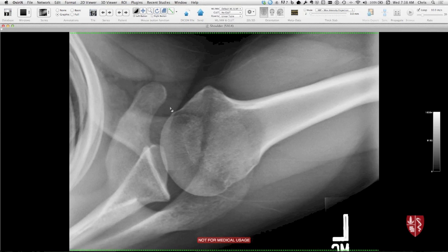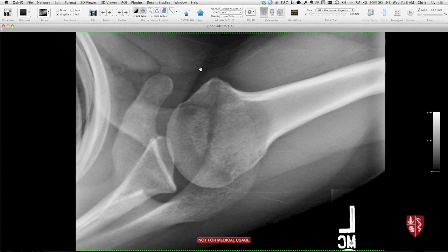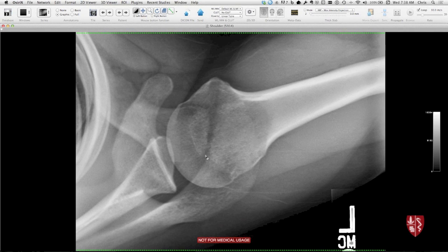The axillary view is real important because that helps us tell about alignment. You can see anteriors here, posteriors here. Here's the glenoid coming out, and it often looks a little bit ovoid because we're not exactly tangential to it. The humeral head should be centered on the glenoid. Here's the coracoid process coming out, projecting anteriorly. And then you can see the acromion scapular spine here, and the clavicle coming across here as well — so here's the distal clavicle. You can really see the AC joint here on this axillary view, and that can help tell if the clavicle is displaced anteriorly or posteriorly.